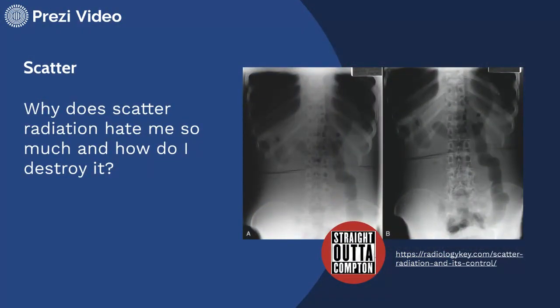So what exactly is scatter radiation, why does it hate us so much, and how do we destroy it are the big questions we're asking today. Looking at this image on the left, we have a whole lot of scatter, contributing to what we call radiographic or image fog, which results in a decrease in image contrast. Versus this image on the right — exact same patient, exact same area — we've had a significant decrease in the scatter that's reached the image receptor, and we see an improvement in contrast.